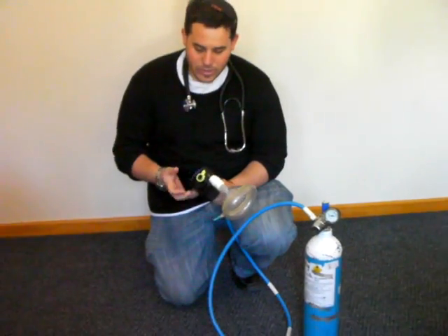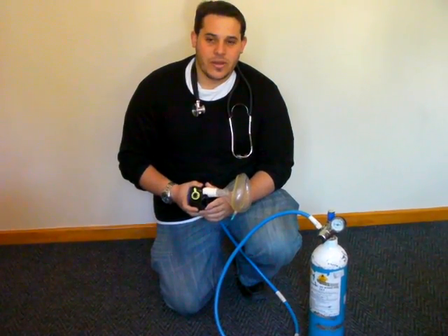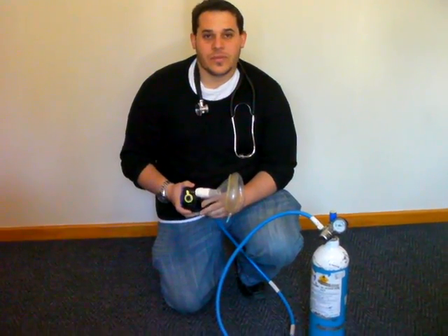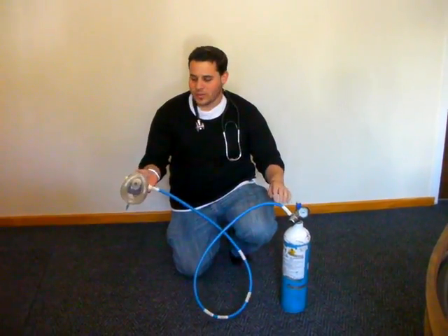Explain to the patient that it's a self-administered gas. When you breathe in, the gas will come in. The onset of action is from 30 to 60 seconds, or 3 to 4 minutes at most. Apply the gas to the patient.